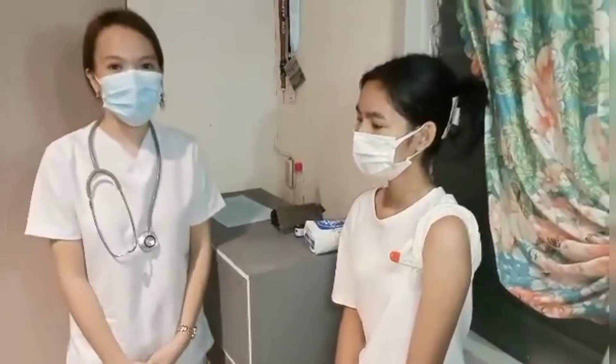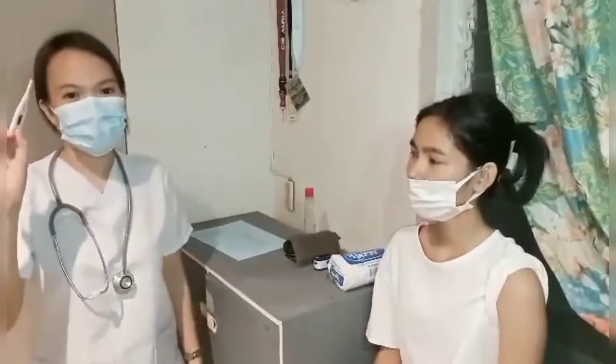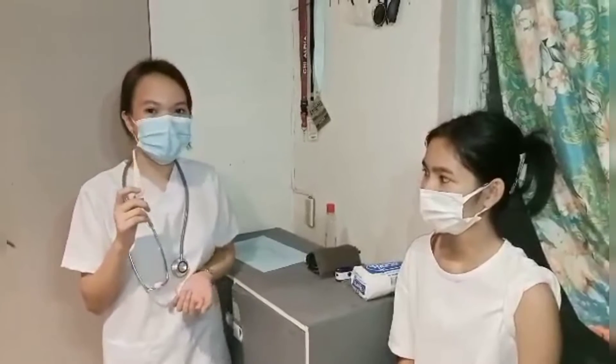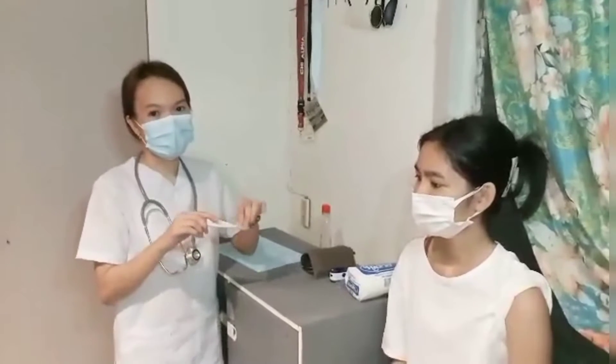We wait for the digital thermometer to beep. I'm going to take the digital thermometer now since it's beeping already and record its reading. Before putting the digital thermometer back in its case, make sure to disinfect it to ensure that it is not contaminated.